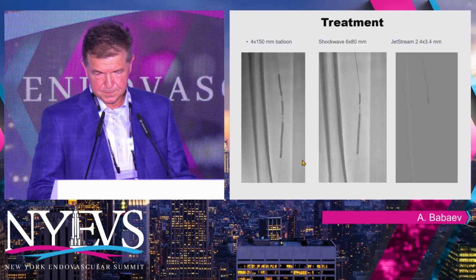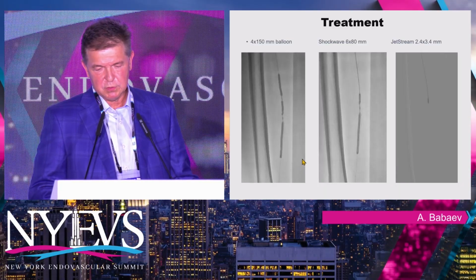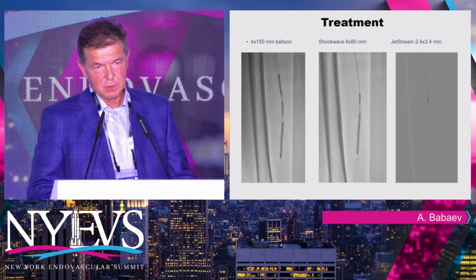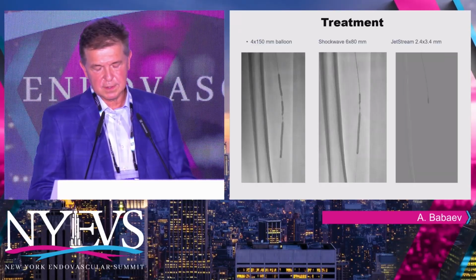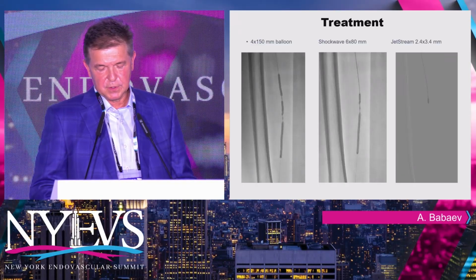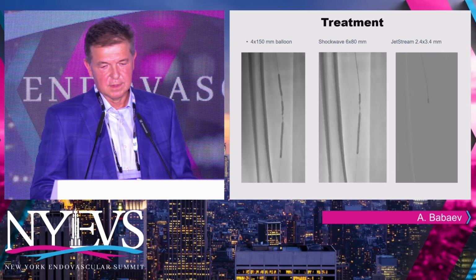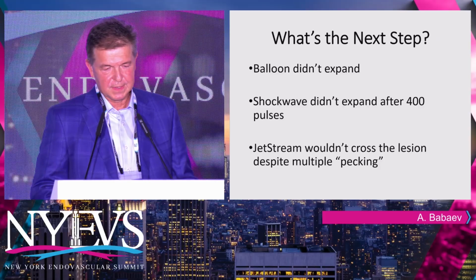We tried to use JetStream, which was 2.4, 3.4. The problem was that the burr would not cross the lesion. We were doing multiple pecking, trying to get through the lesion, and it didn't do anything. So the question is, what's next, right?